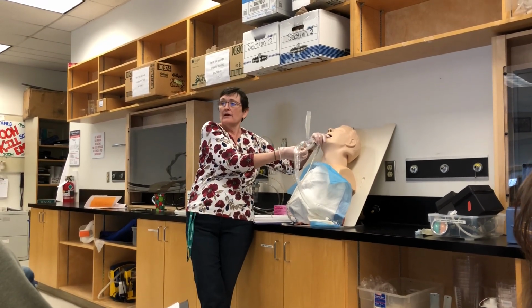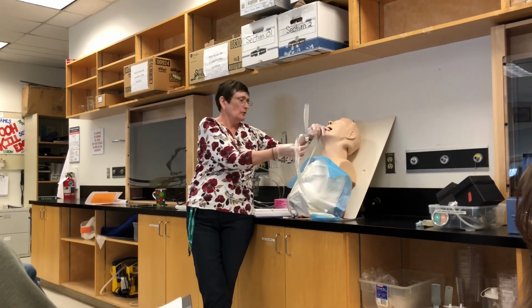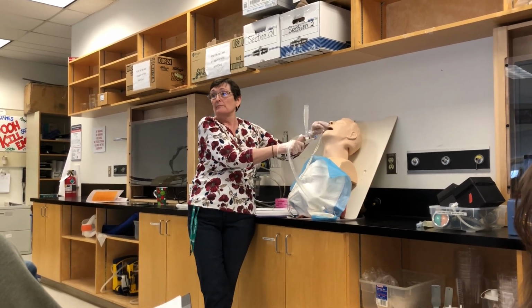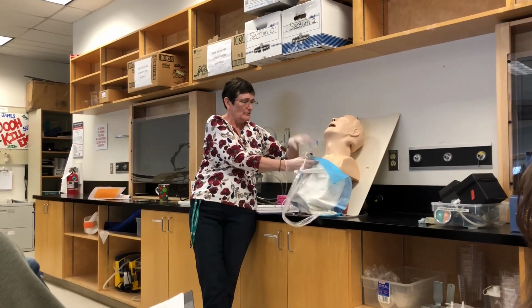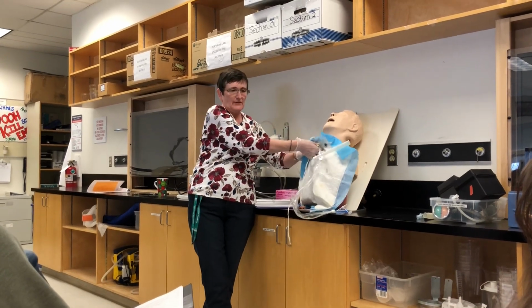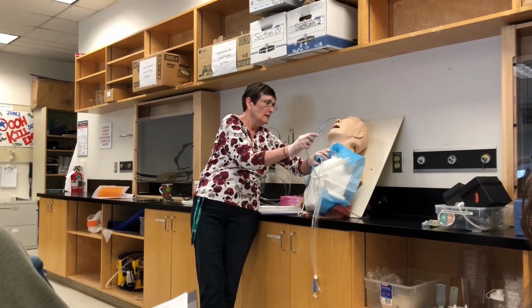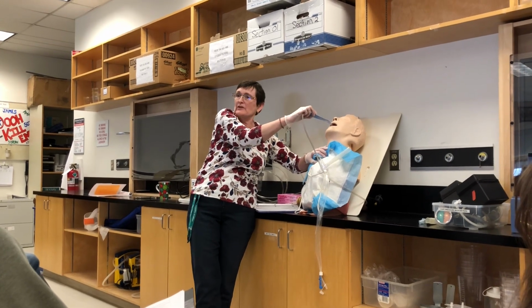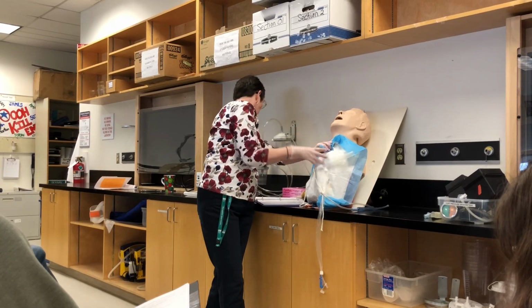Okay, so big breath, 1. Another big breath, 2. Okay, big breath, and I deflate the cuff at peak inspiration. We're going to pull it out. Obviously that was not lube. Okay, he's going to cough, cough, cough. Suction. We don't have to go way at the back of the throat. I'm just going to put it there just like at the dentist. He's going to cough up into it, and then we can put the mask on.